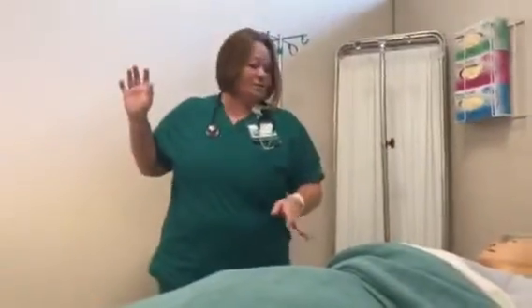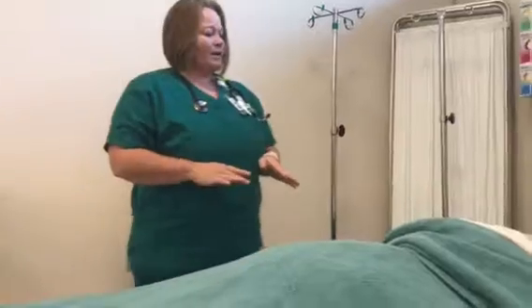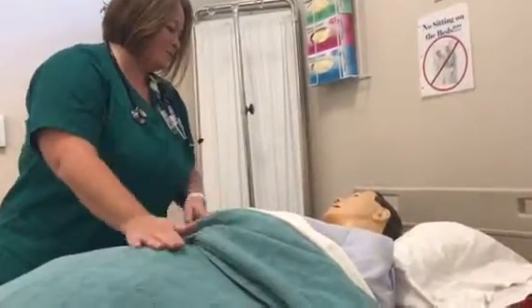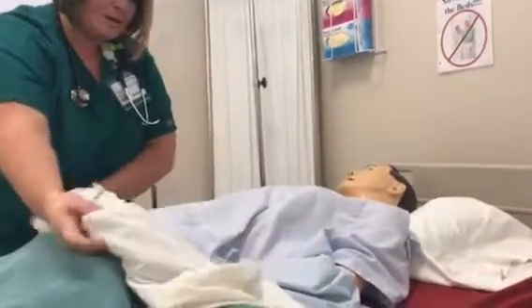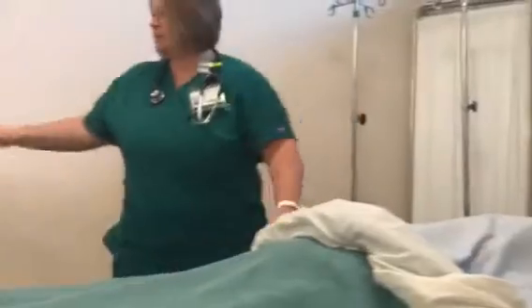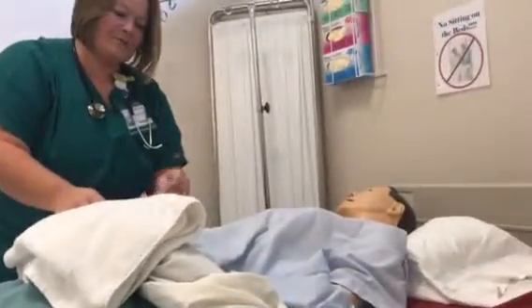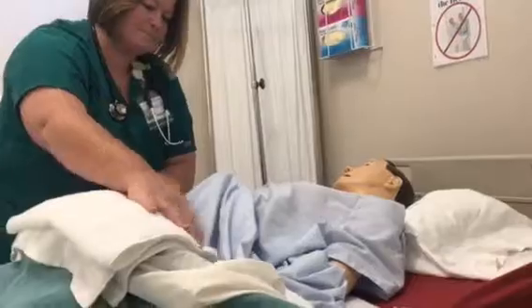I'm just going to go ahead and pull this curtain. I'm going to perform hand hygiene. I'm going to come back. Now, Mr. Pearson, the first thing that I need to do is I need to listen for bowel sounds. Would that be okay? I'm going to uncover you here just a little bit. And what I'm going to do is place a towel, okay? Sometimes this can be a little messy. We'll do our best not to let that happen. So I'm just going to place a towel here.